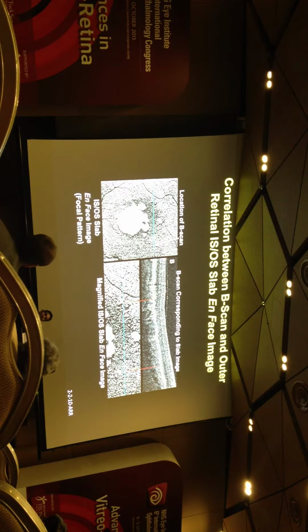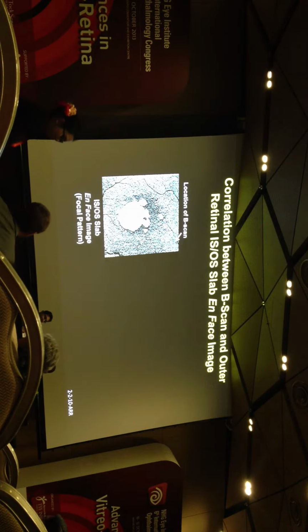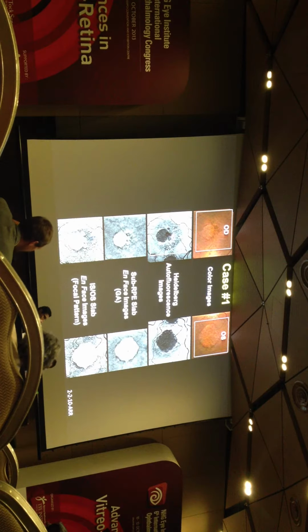Can you go back on that real quick? Yeah, the autofluorescence is very useful too. I was asking, do you think that the increased autofluorescence is due to the thickness of the RPE, or due to the fact that you don't have any more masking photoreceptors? Yes, you're actually losing the photoreceptors. So it's like you're bleaching, right? Exactly. If you bleach, probably the autofluorescence should not be seen.